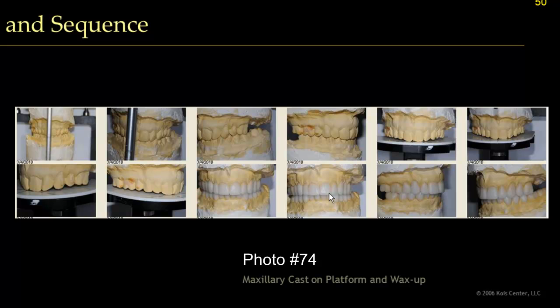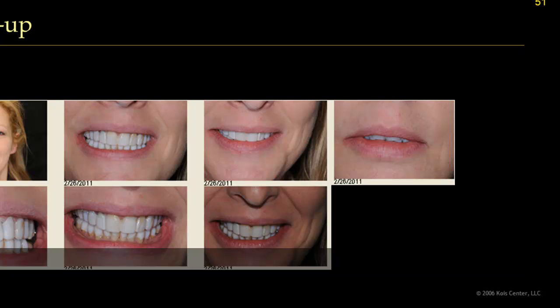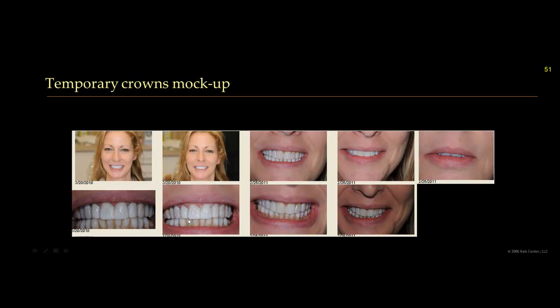But you can look at these pictures of how we did the wax up. We increased her vertical dimension, and the technician gave me a matrix, and I applied it to her teeth. But the problem is, probably everybody had the same problem. When you apply those temporaries, it's not going to be the same bite as what you see in the articulator. You can see on this picture that on the right side and the left side I have an open bite, and I was curious why it was happening, because again we don't have a reference point for how we restore those teeth. So I have to equilibrate the patient's mouth in the chair, but again when you equilibrate, which teeth do you have to grind and which teeth do you have to leave as is? So again, when you put the teeth to the face, that's going to give you a reference point.